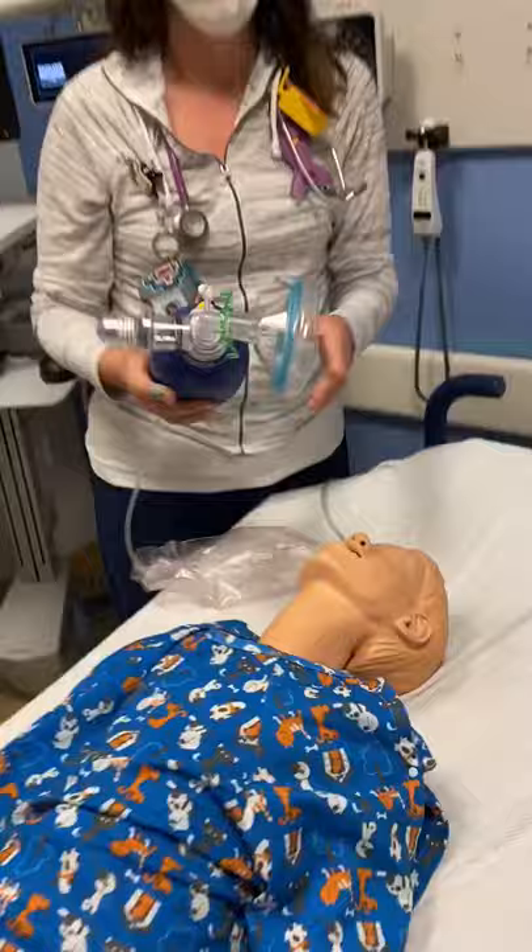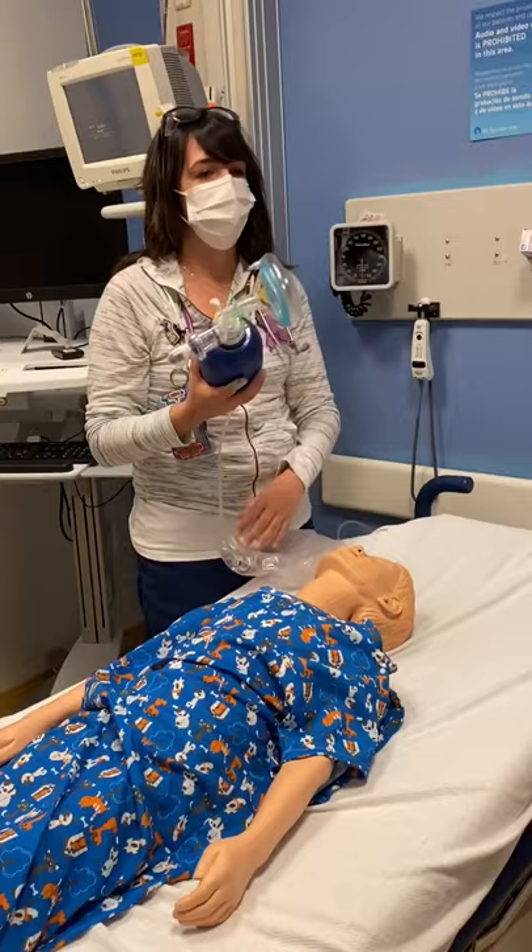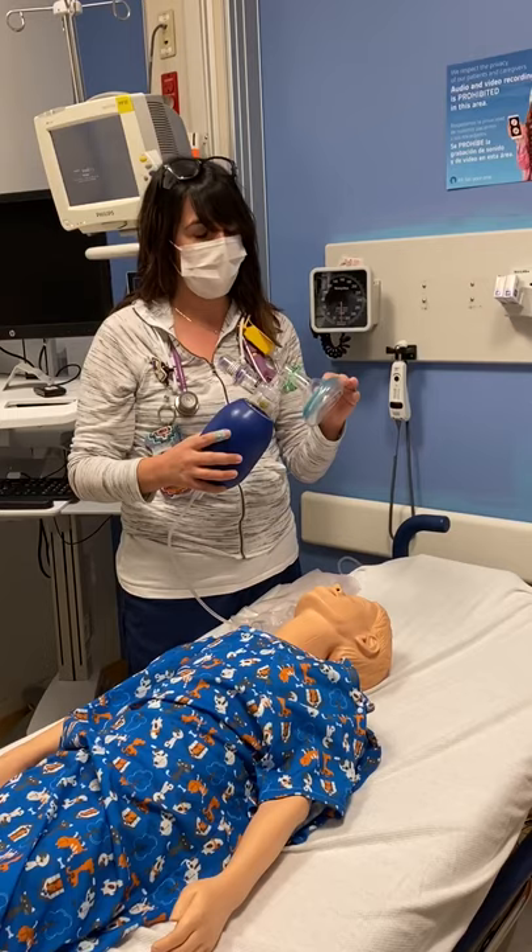Self-inflating bags can be used with or without oxygen. When used without oxygen, it will deliver 21%. When attached to oxygen at 10 to 12 liters per minute, it will deliver 40 to 60% FiO2.